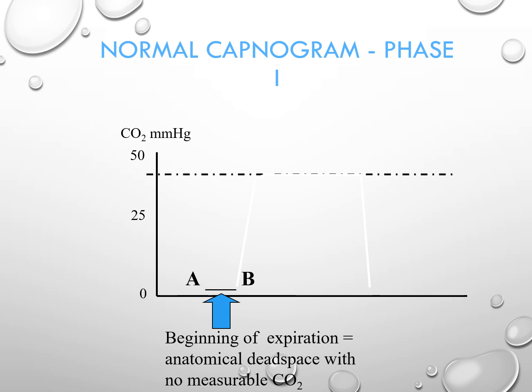So it has essentially no CO2, and there is no CO2 in that gas.